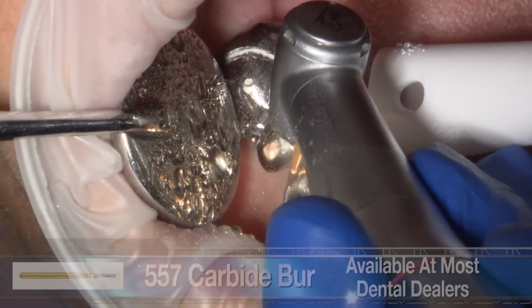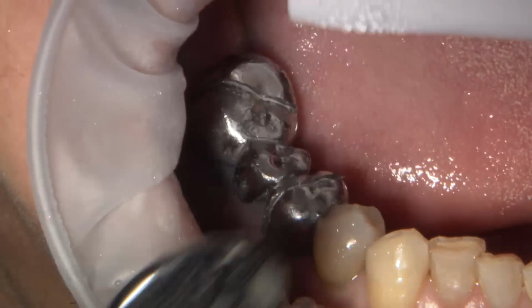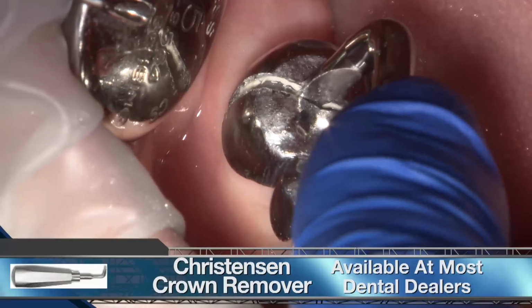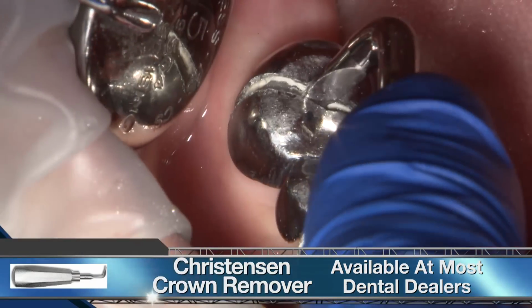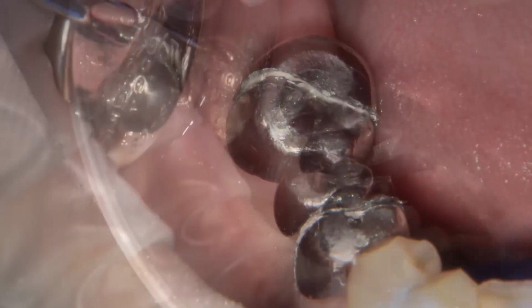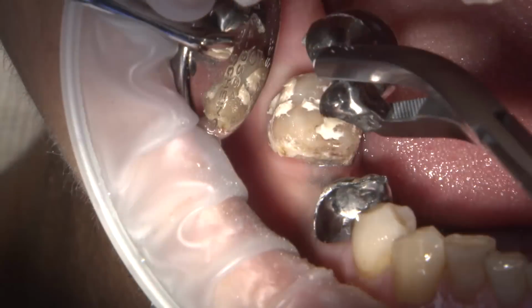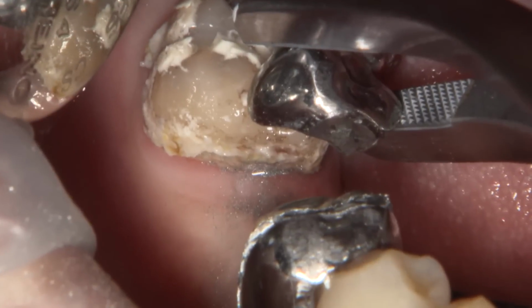I made the cut along the vertical and occlusal of 31 and 29 and used a Christensen crown remover to break the cement bond. I knew that if I grabbed the Pontic area, only one piece would come off, and the other would remain behind since the pieces were not connected.